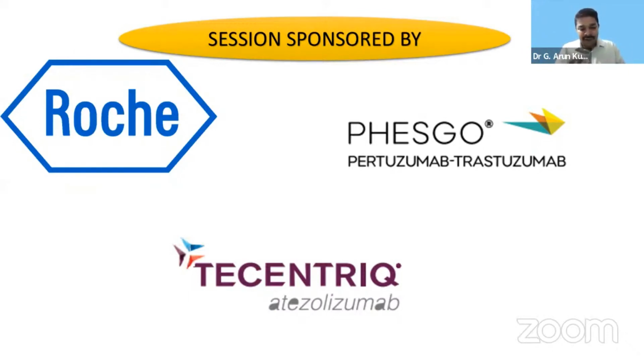Now, the second question is about the germline origin. Generally, any variant allele fraction of around 50% plus or minus 5%, I would say, standard deviation, could be suggestive of germline origin. It's true for all the genes, but generally you don't find germline mutations in EGFR, for example. So it is clinically more relevant if it is in genes like BRCA or RAD51 or MMR genes like MSH6 or PMS2, etc.